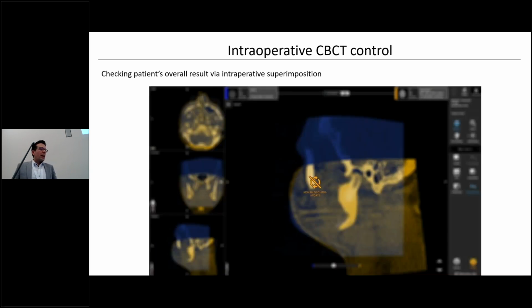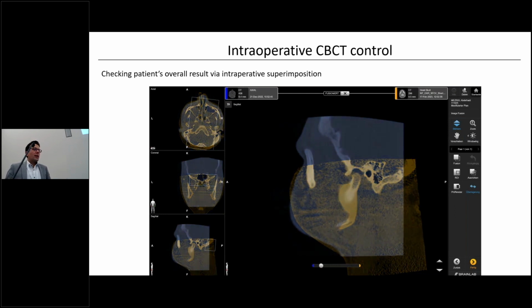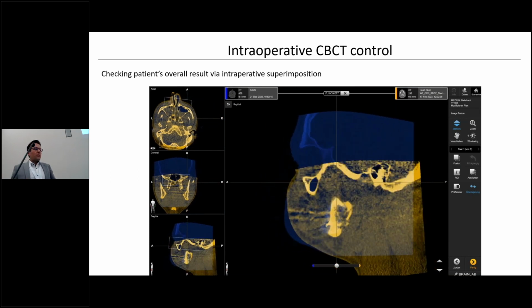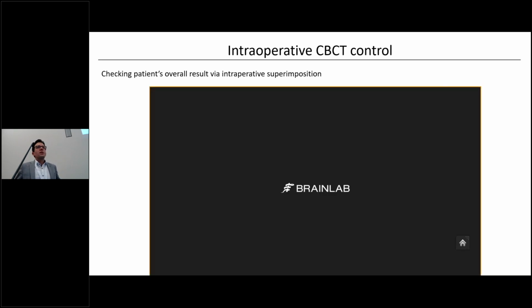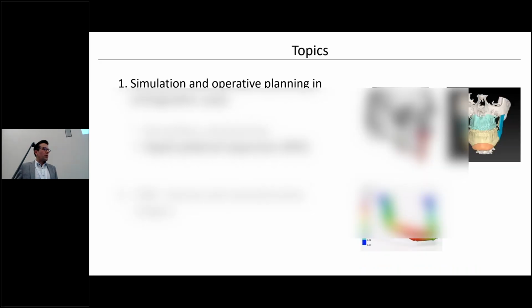And second, you can do the intraoperative CBCT scan, and for example, considering the condyles, you can just double check if the pre-op and now intra-op, so almost post-op, situation is exactly the same. Have we any further problem, or can we just finish the operation like this? For me personally, this is one item where we could increase our accuracy intraoperatively, but of course, the whole teamwork, the whole work done around this operation is not daily routine. It just takes too long if we do that with each and every case. This was a patient we operated with this intraoperative scanning, after 3 months, and the pre-op picture.